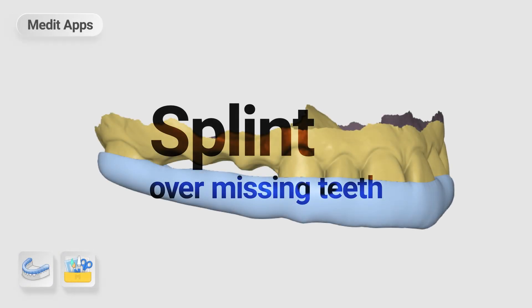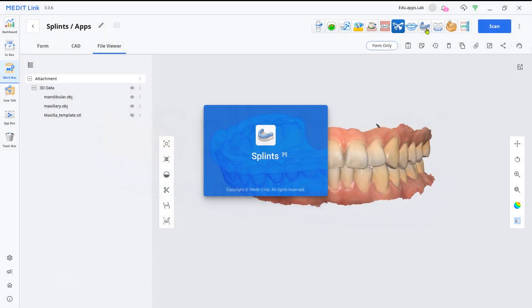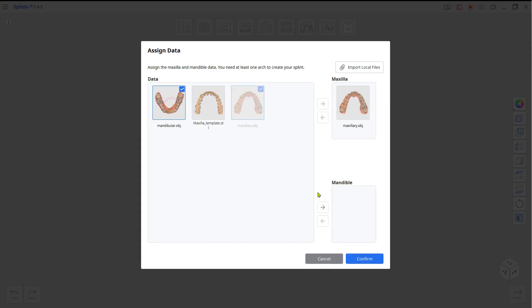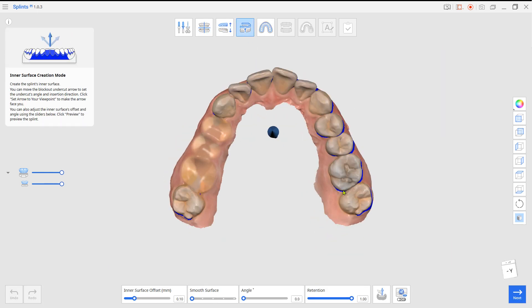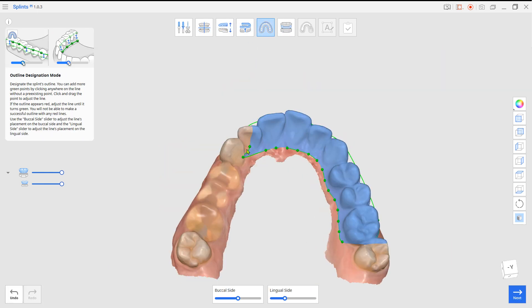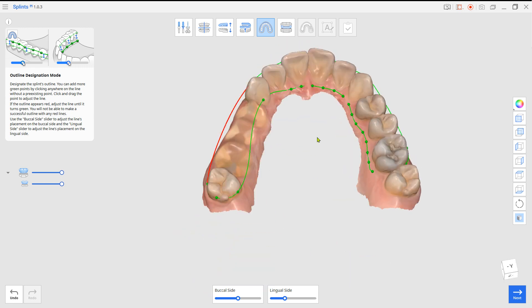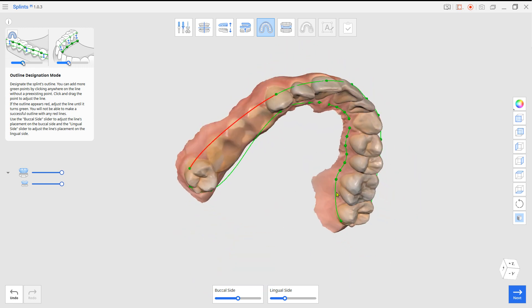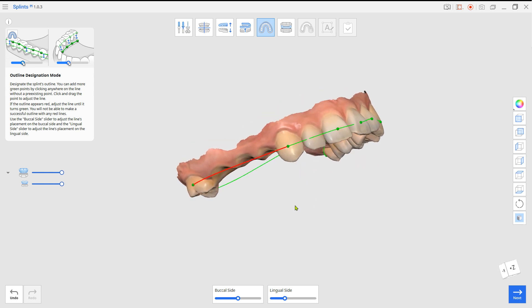This is a quick guide on how to design a splint when there are missing teeth with the Splints and Design apps. With more than two missing teeth, it would be hard to design a splint due to the large gap. If this is the case, there are two options you can take.